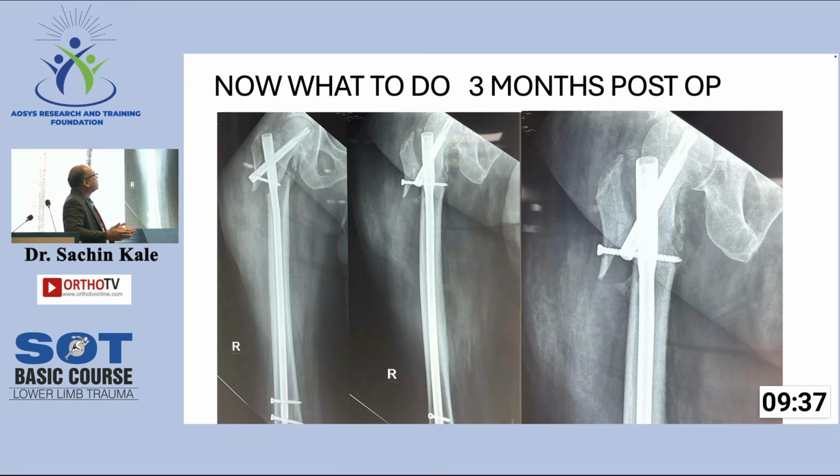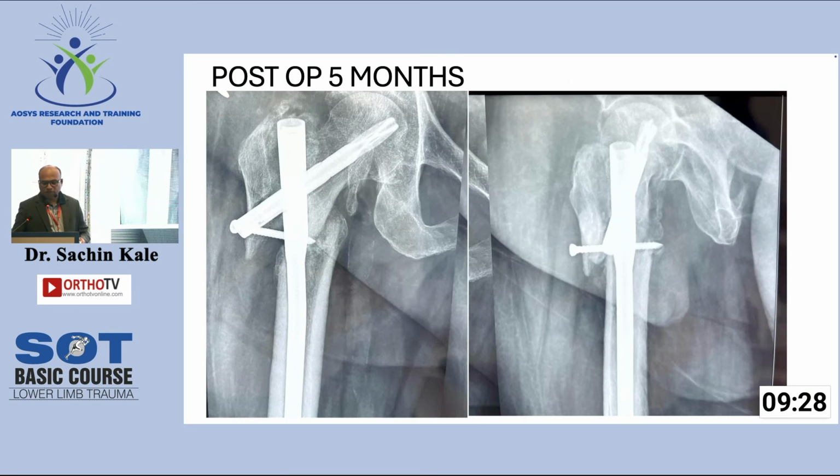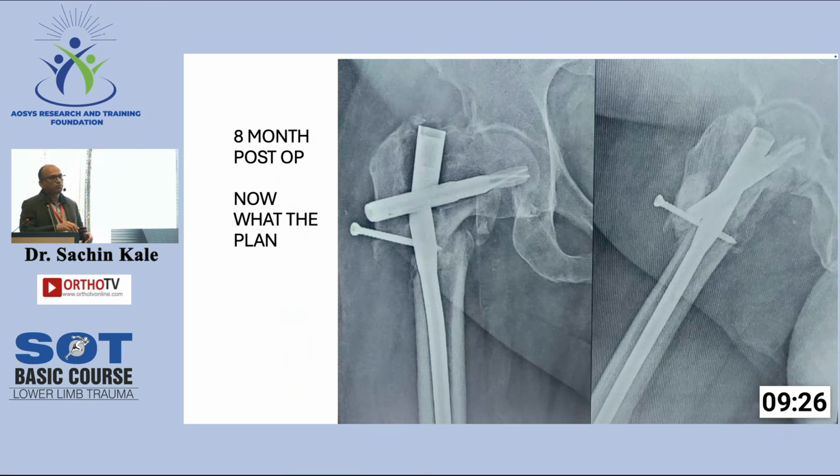So there is a fracture. The lateral wall is completely out. The implant, so you feel this will hold? Now 3 months. No, sir. No, it will not hold. Absolutely right you are. So now 5 months and then 8 months, the implant, because the fracture has to unite or the implant breaks. Most likely the implant has broken here because of varus reduction, not good fixation properly, and then the implant broke. So any tips and tricks of removing this implant now?